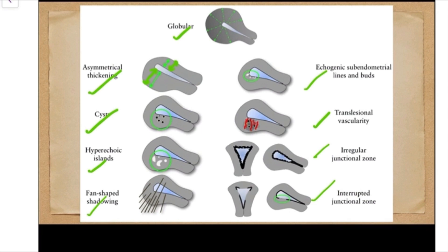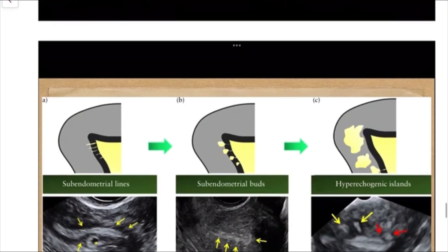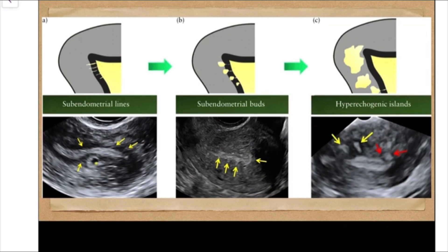By seeing these eight to nine features we are sure we are dealing with adenomyosis. For example, here we can see subendometrial echogenic lines, a cystic lesion with an echogenic rim (the myometrial cyst), echogenic buds, and hyperechoic islands — some of those islands also having a hypoechoic halo. This is a subendometrial bud with a subendometrial line. Seeing all these confirms adenomyosis.